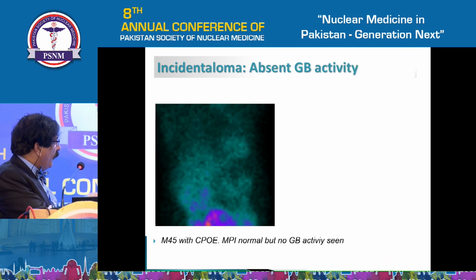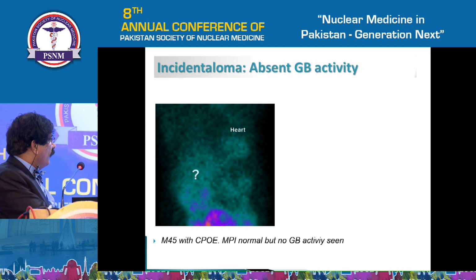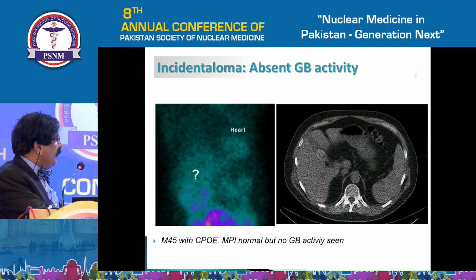I also always look at these raw images to see if there is absent gallbladder activity, to look for gallbladder problems. And here we don't see any gallbladder activity, and then we look at that and we have a stone in the neck of the gallbladder.